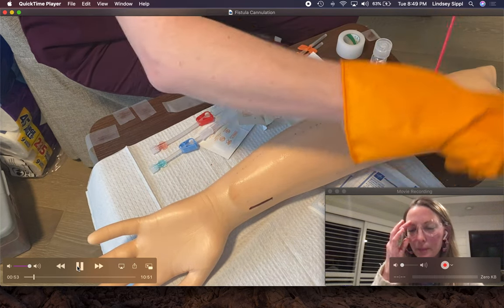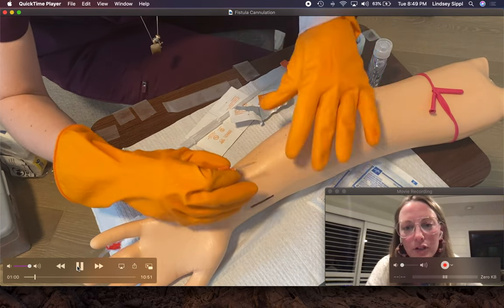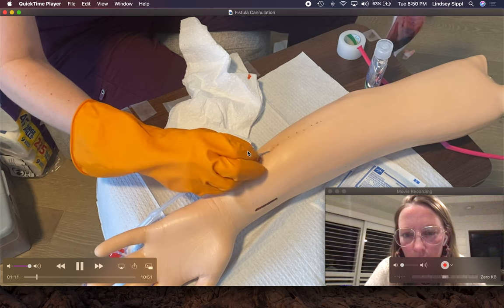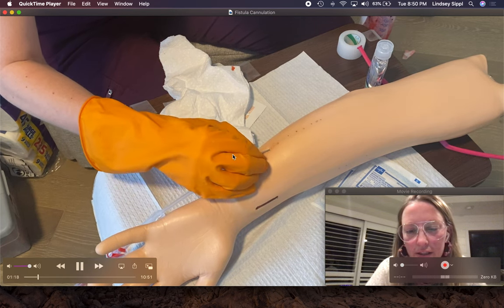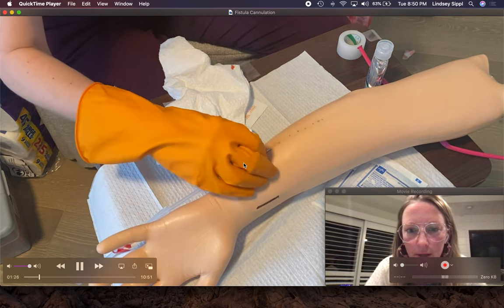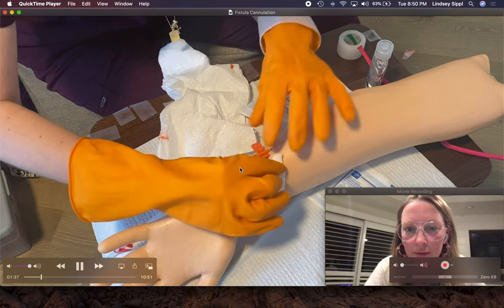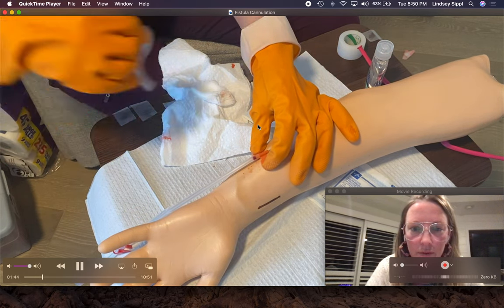I'm not going to touch that cleaned site. I'm going to put the tourniquet on and then I am going to cannulate. I'm going to pick my site and insert my needle slowly, watching the tubing for blood return. When I've got blood, what you want to see is this pulse. My needle is in, I had good blood return. I'm going to clean around the site without taking my hand off the needle, and then tape it down.